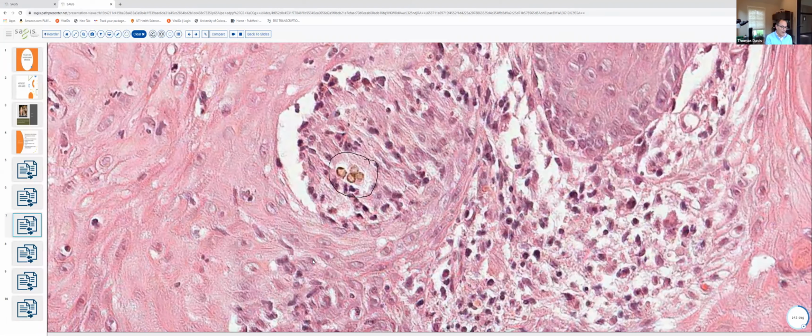And the thing to keep in mind is these sclerotic bodies or medlar bodies are spores. Now, there may be internal septation in these, but the one thing you will not see is branching septate hyphal elements. And that's really what distinguishes a Phaeohyphomycotic cyst from chromomycosis.